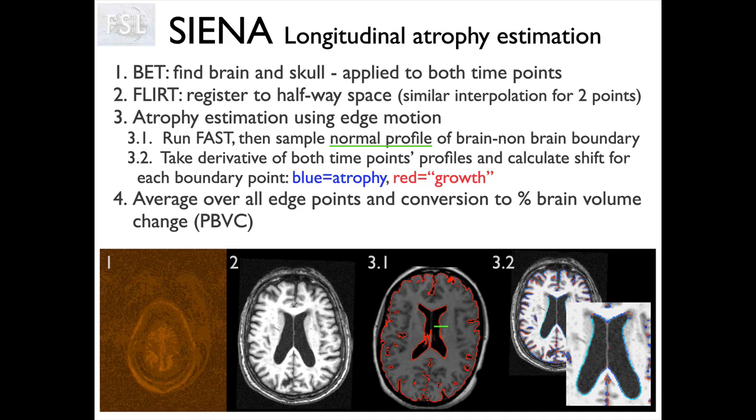So we really want to be sensitive to these changes, and that calibration doesn't normally change actually that much. It's really quite stable, but over time it can drift a little bit. And so when you're doing longitudinal imaging on a particular scanner, it's one of the things to be aware of. And that's why we are estimating the skull and trying to use that to help us come up with something which can measure how much that scaling might have changed. We have to use the skull rather than the brain, because actually we're interested in neurodegeneration and atrophy. So we expect that the brain is changing, and that that's nothing to do with the scanner, that's to do with the actual biology. But we don't think the skull will be changing.